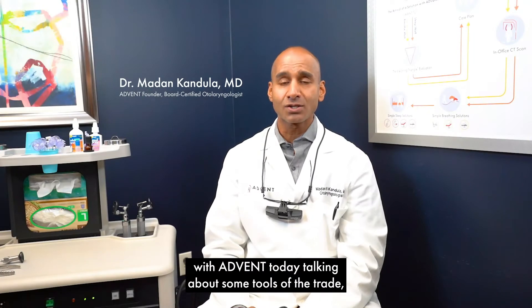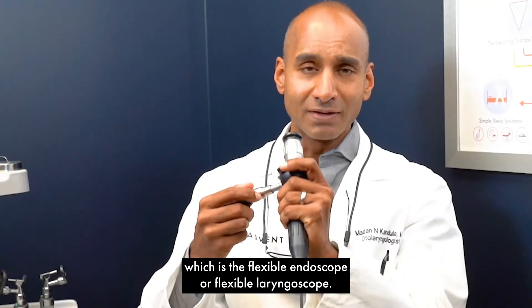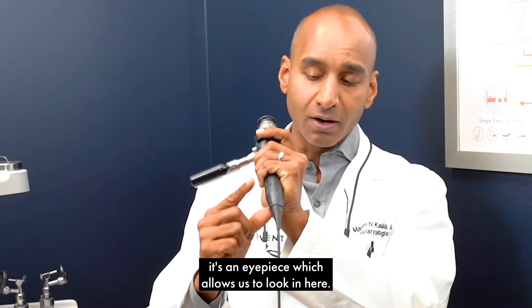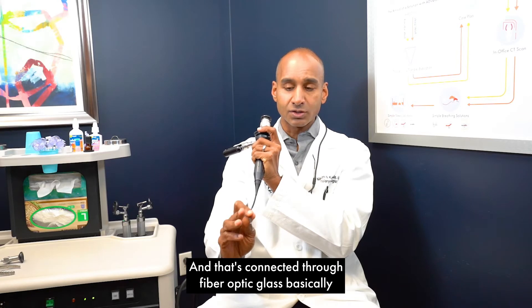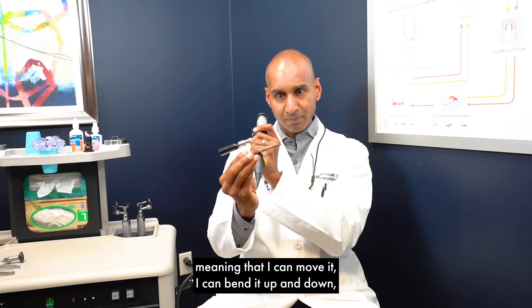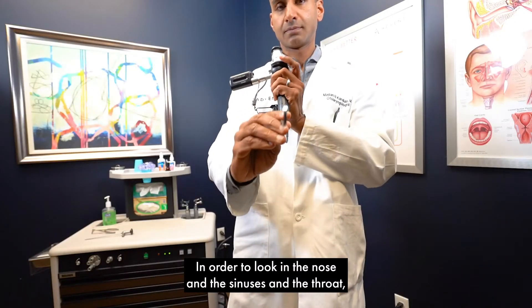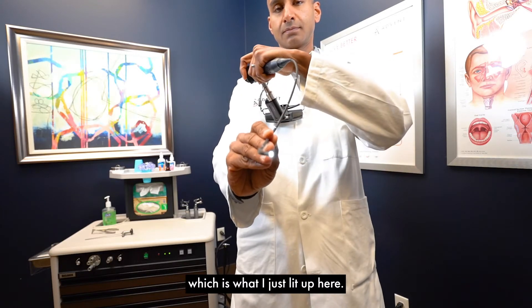Dr. Muthan Candula with ADVENT, talking about some tools of the trade — specifically this flexible endoscope, or flexible laryngoscope. It has an eyepiece connected through fiber optic glass to the tip, and it's flexible, meaning I can bend it up and down and spin it left, right, up, down — whatever I need to look into the nose, sinuses, and throat. We use this little light source, which I just lit up here.